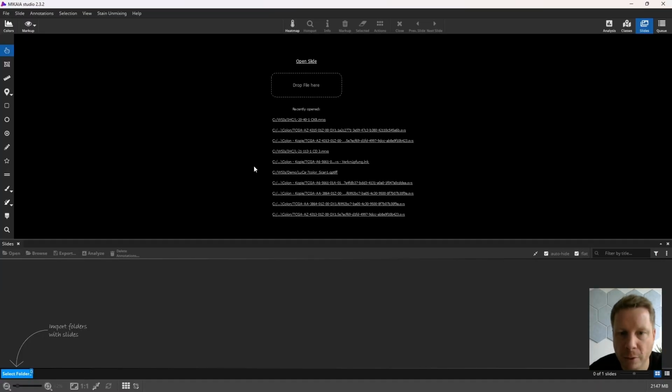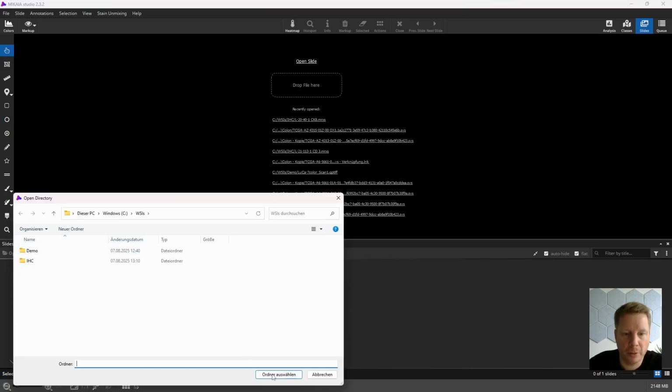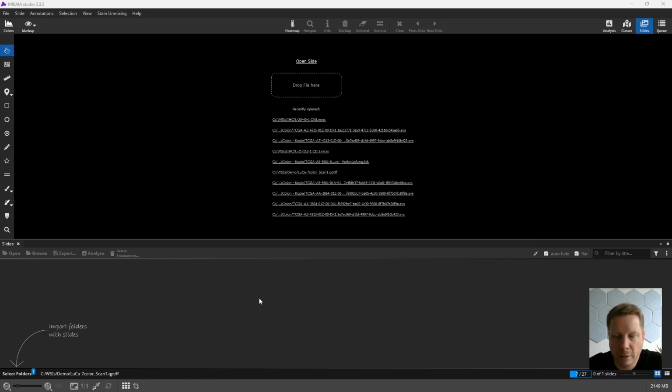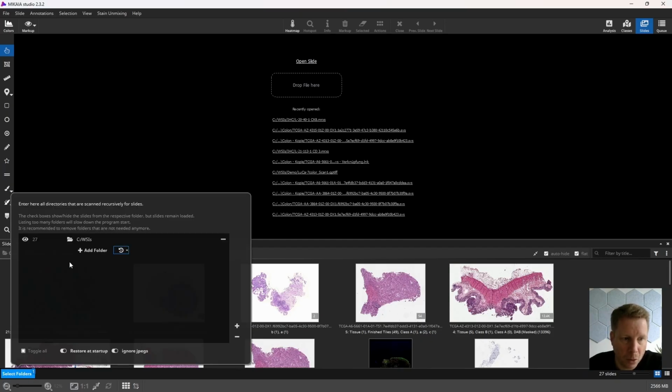Hi, my name is Volker Bruns, and in this video I would like to give you a brief orientation into MIKAIA. So the first thing that you would normally like to do is point MIKAIA to the folder that contains your data set, from your current study that you would like to work with, or it could be multiple folders. They can be local folders or on a network share.